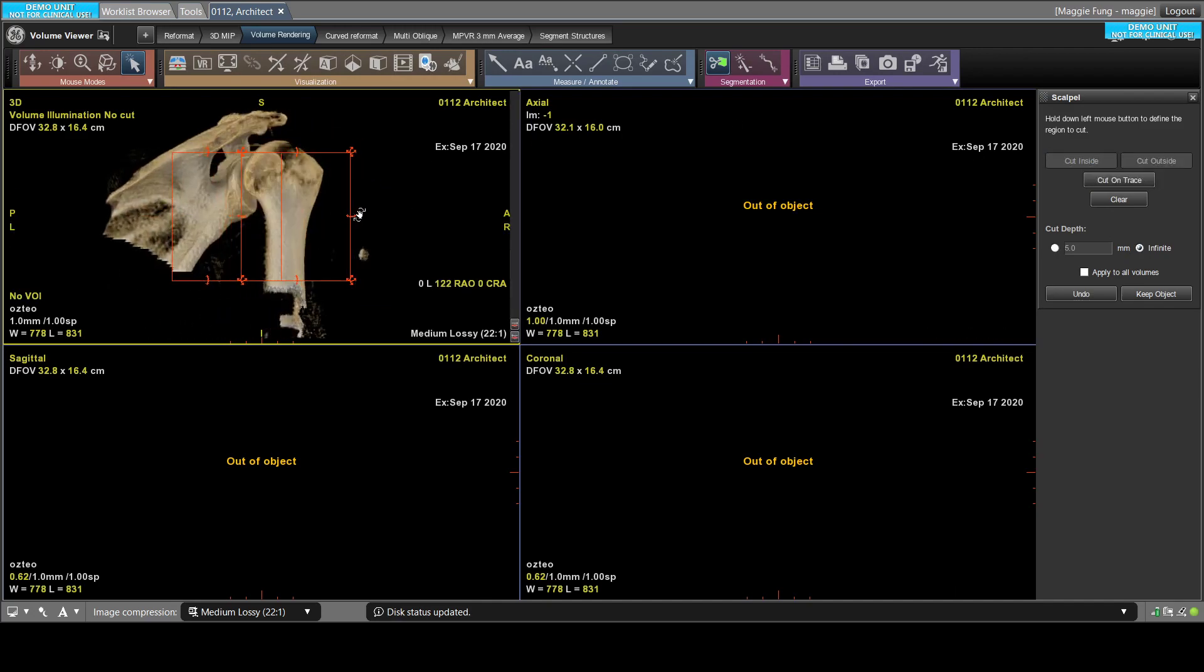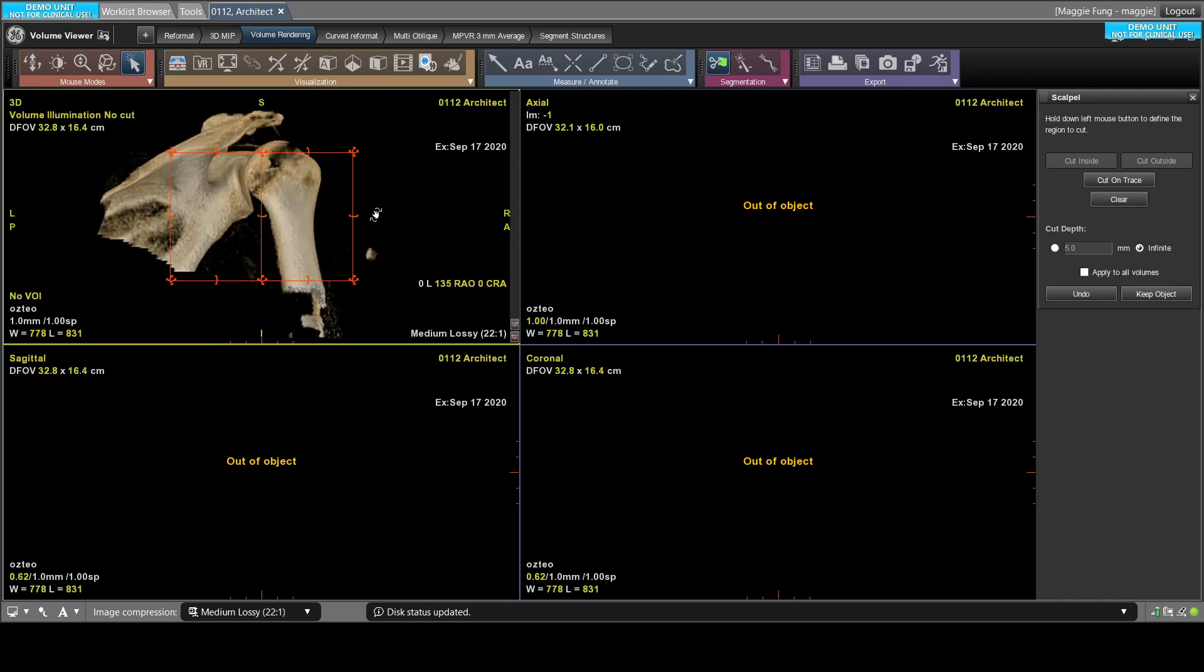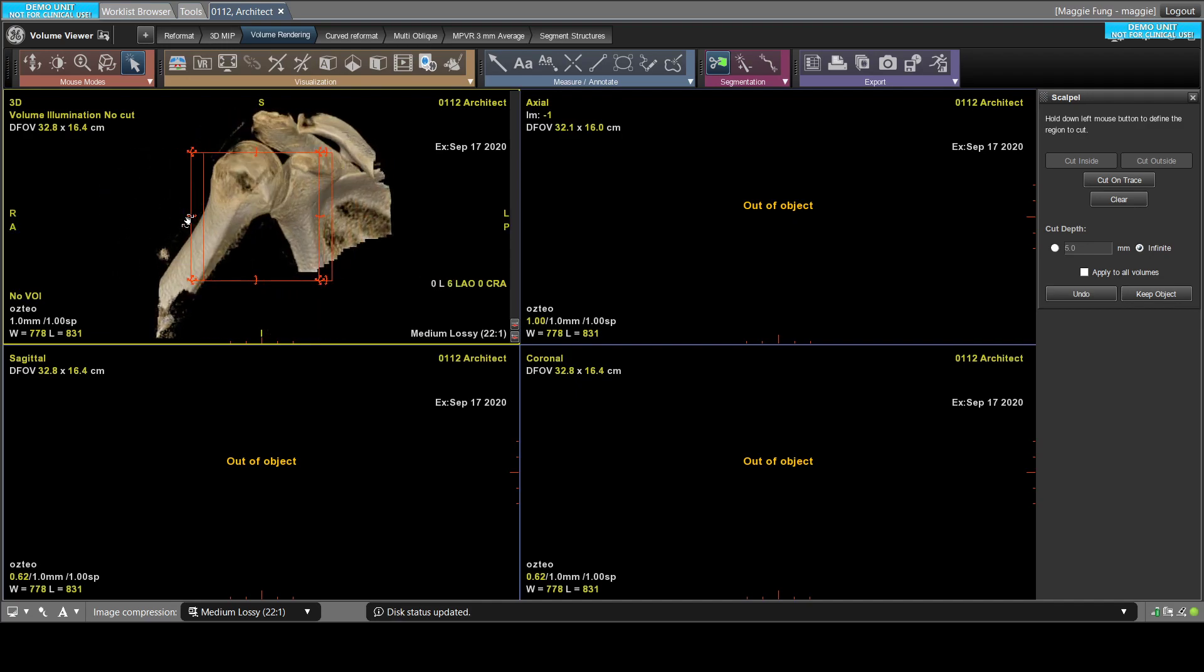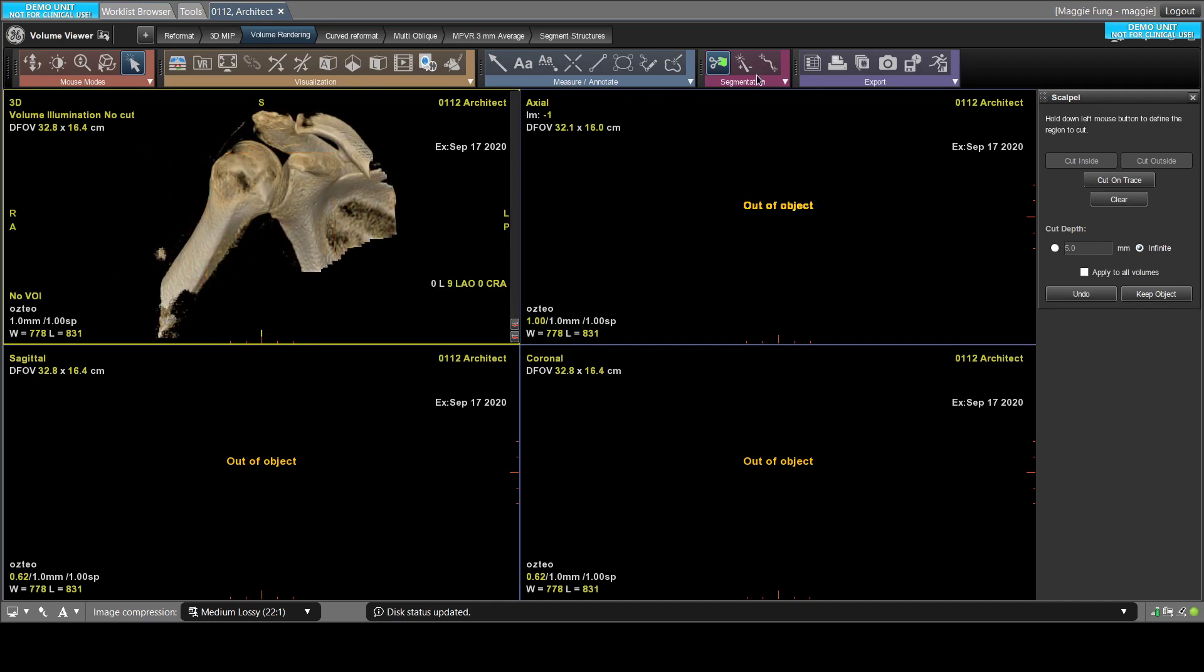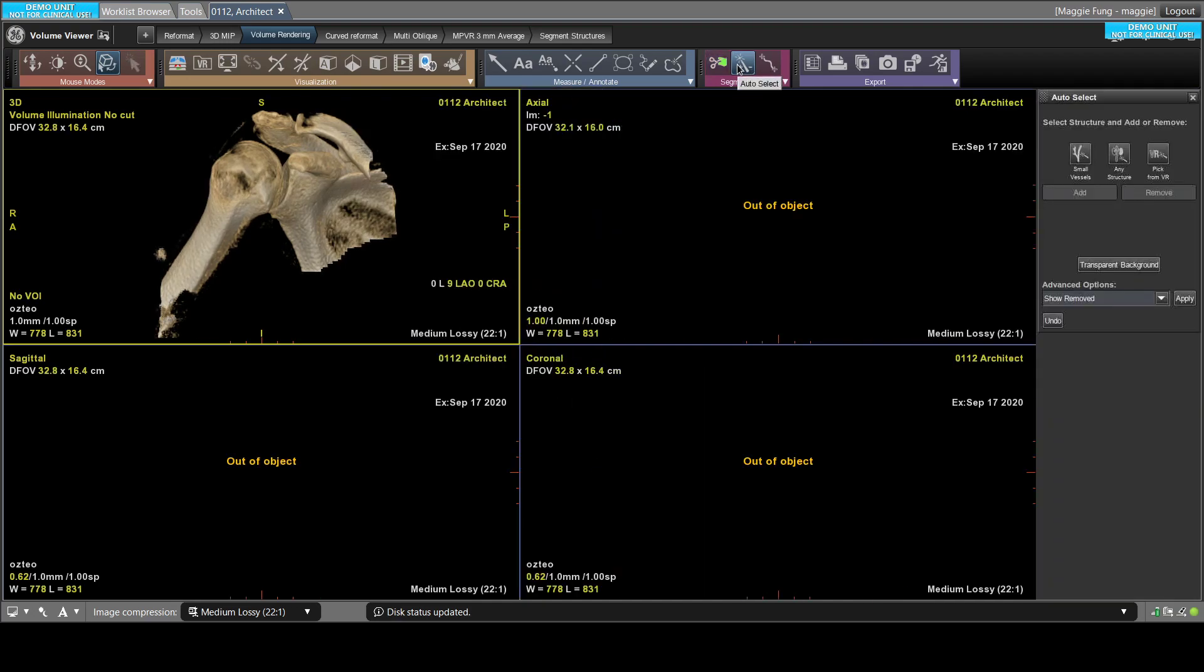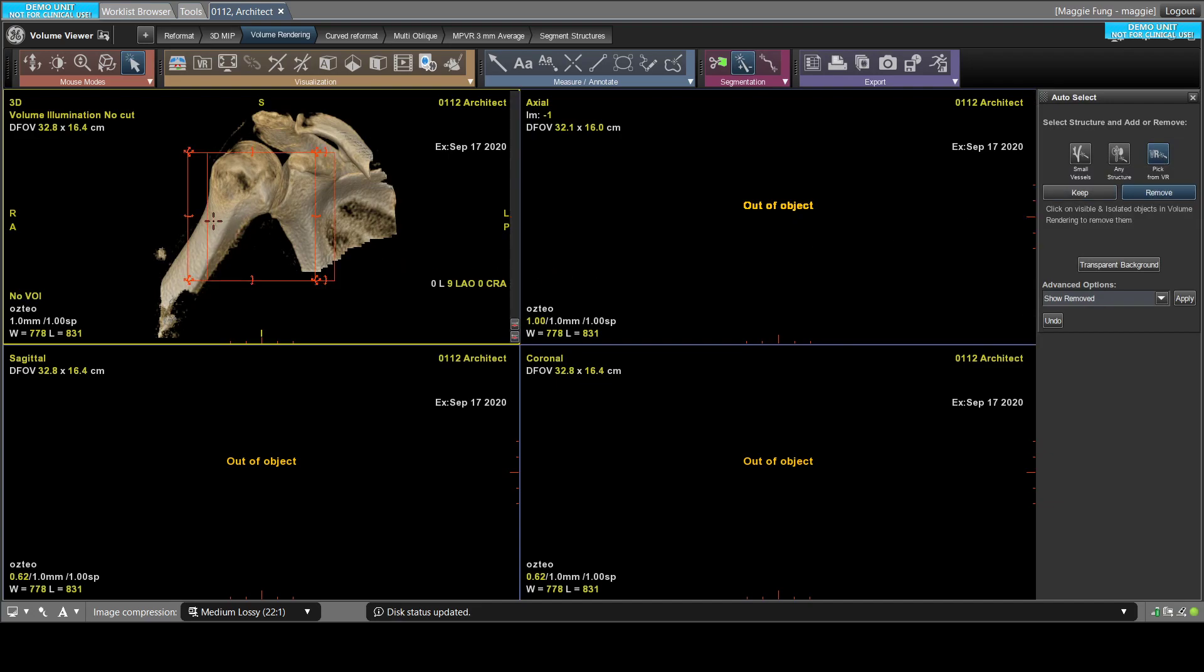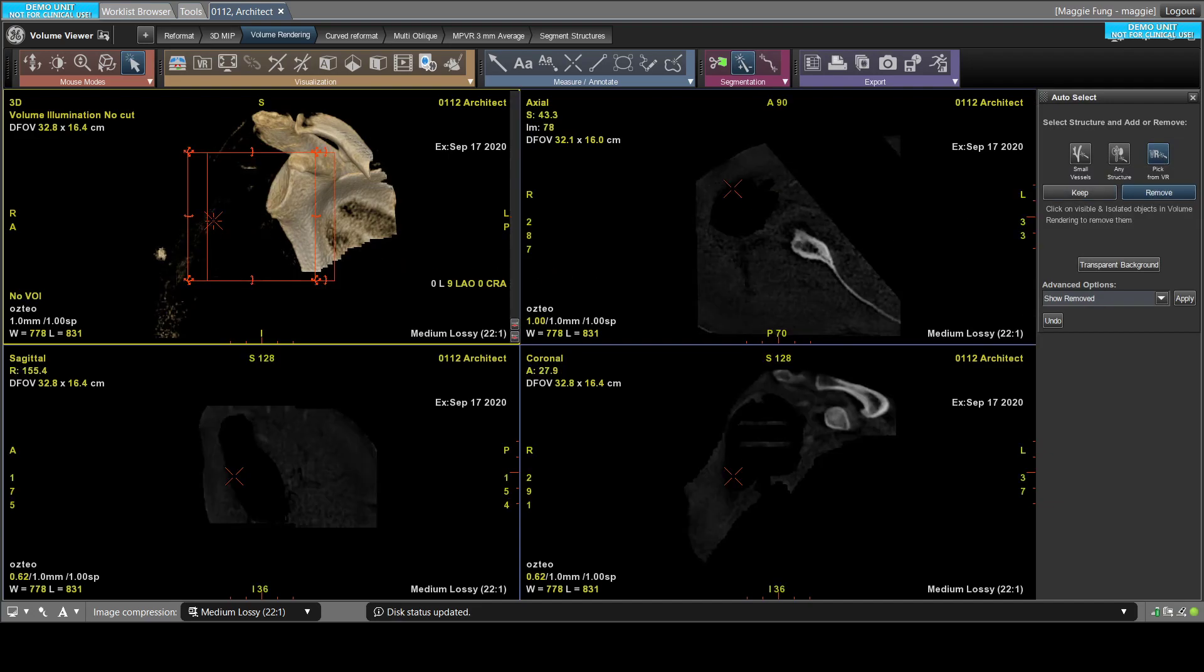So some people want to measure the glenoid bone, for example. Then what you want to do is you want to cut out the humerus bone by using the auto select tool. So you can choose pick from VR, and it's on the remove mode already. So you just need to click on the bone, and voila, this is done.